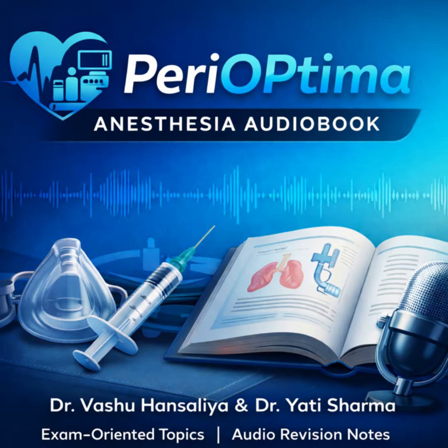You should definitely mention POCUS-related work on using ultrasound during the pulse checks in a cardiac arrest to differentiate the causes of PEA, or pulseless electrical activity. Right. You're looking for reversible causes. Is it a massive PE? Is it tamponade? Is it severe hypovolemia? It guides your ACLS algorithm.